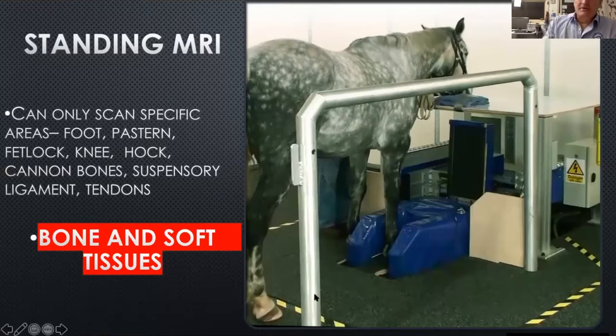This unit is on a little hoist device — we can move it up and down. So if we want to look at the knee, it will come up out of the floor and sit on either side of the knee. The horse has to be really still because these images take about 45 seconds each to gather, not quite as long as the bone scanner, but they do take time.